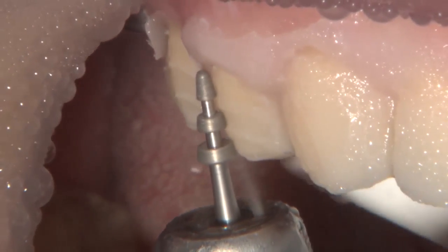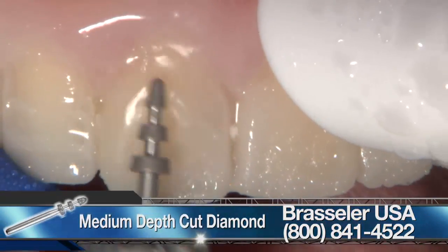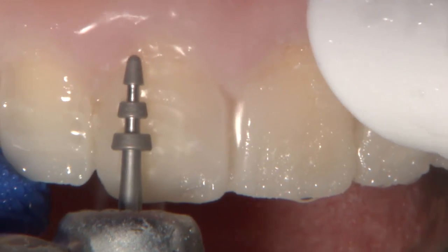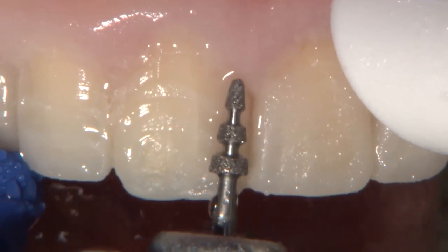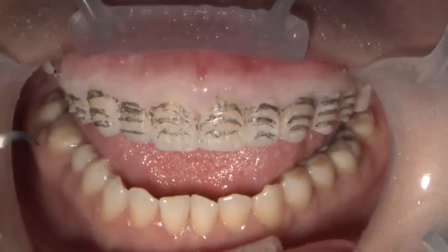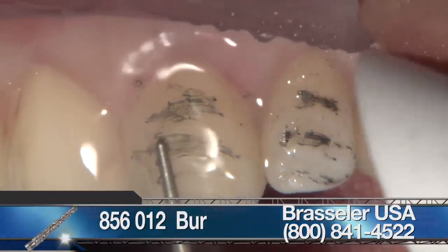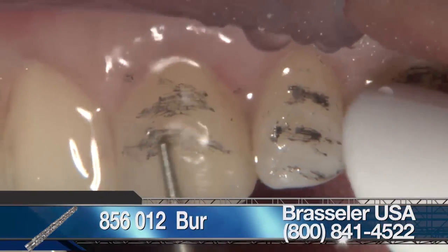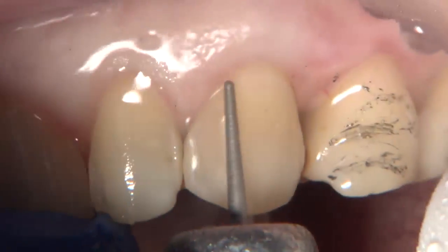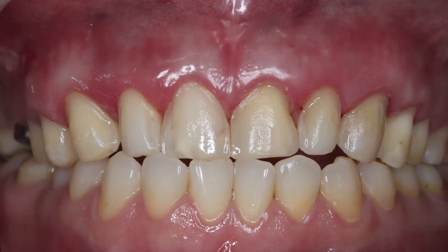I used this set to place facial depth cuts. Here I used a depth cut burr from Brasseler USA that provided a 0.3 millimeter depth gingivally, 0.5 millimeter at the middle third, and 0.7 millimeter incisally, providing a preparation that follows three different planes. Once I was done with the depth cut, I marked the horizontal grooves with a pencil and used the curette to flick the matrix off. To finish the preparation, an 856-012 round-ended diamond burr was also used from Brasseler. This temporary mock-up prevents any unnecessary entry into the tooth and helped keep the preparation on the enamel and precisely control the facial depth cuts.